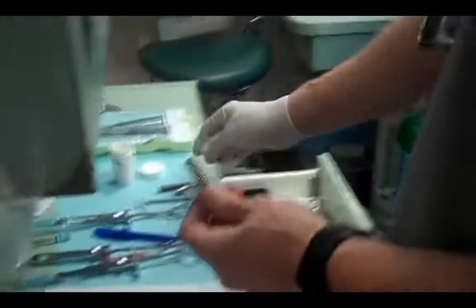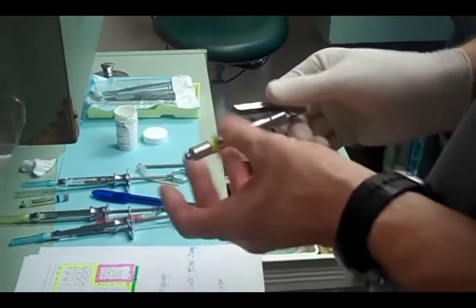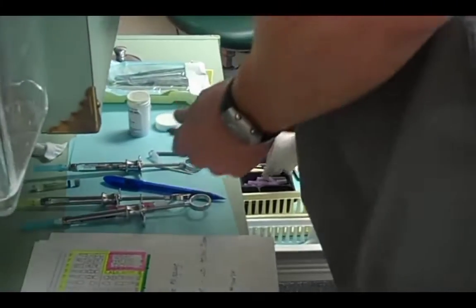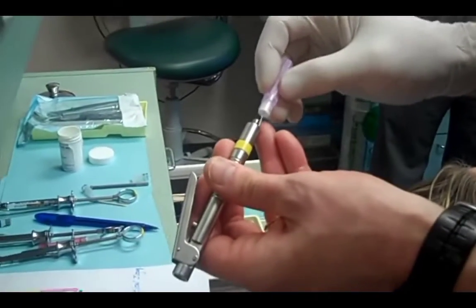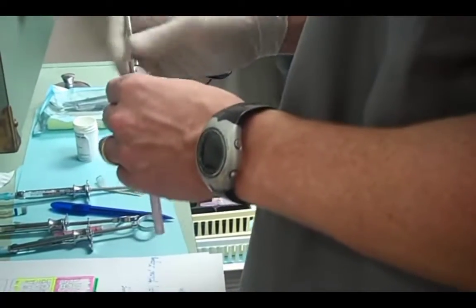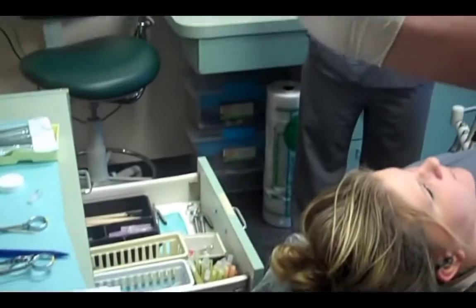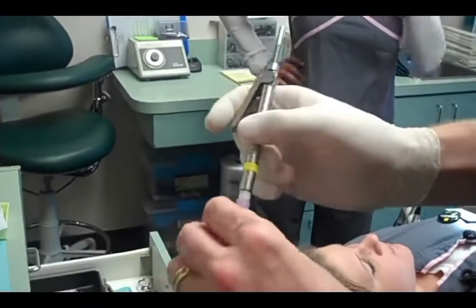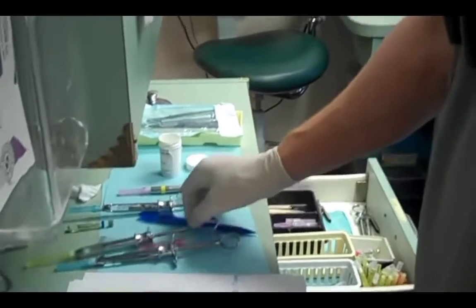I also use something called a Ligojet. We use the Ligojet with Septocaine, in cases where we have a hot tooth that doesn't get numb as easily as it should. This is pressure anesthesia, and we use the purple needle with that. Good for lower molars, good for endodontic teeth that don't get numb, and it's a pressure-based anesthetic with a short tip like that. All you have to do is load it up like that. I almost never use it for uppers, mostly for lowers.